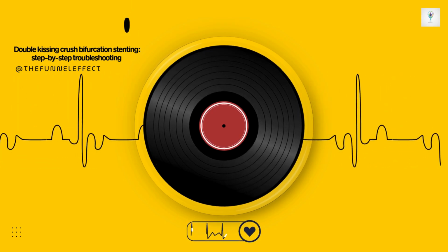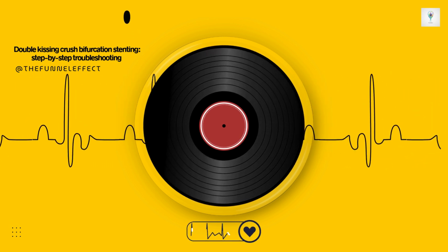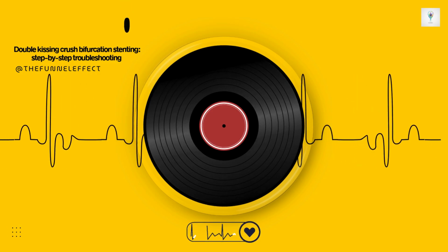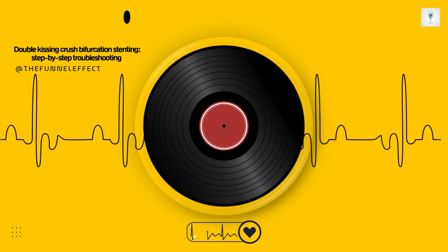The idea is to gently nudge the crushed stent struts away from the trapped wire tip, freeing it up enough so you can then withdraw it carefully. Pushing something into that crushed segment sounds risky too, though. Like you could cause more damage. How often does that work without problems?